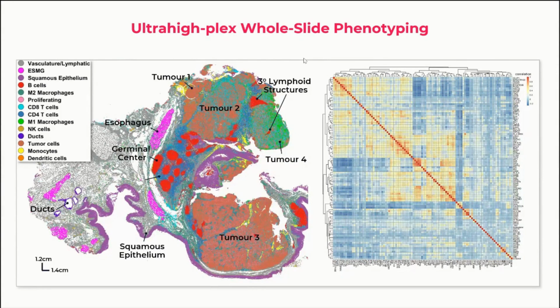So we have tumor region 1, 2, 3, and 4. And the tertiary lymphoid structures are identified in that tumor region 4. They're absent in tumor region 2, 1, and 3. There are sort of remnants of TLS-like structures in tumor region 3, but they're not structured and they're not large. They're not infiltrating the tumor. So these are sort of naive aggregates.